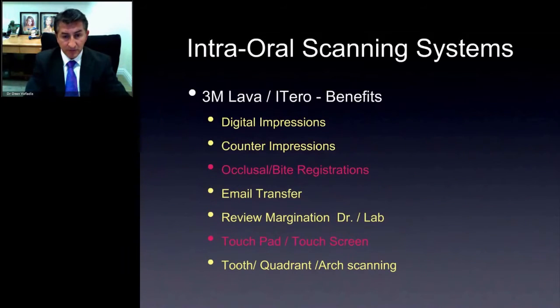Again, the benefit that we see is the occlusal bite registrations that are really accurate. When we're mounting the model on regular stone casts, that occlusion may not be perfect, depending on who's mounting it, if it's a quadrant, if it's a full arch. That accuracy is not 100% there, and that's why we find ourselves grinding our porcelain when we're trying in our restorations. With digital CAD CAM, that occlusal registration is done with 3,000 or more pixels that gives you a beautiful, perfect occlusion. So when the model comes back, that occlusal adjustment is minimized. Again, time is saved and the accuracy is there.